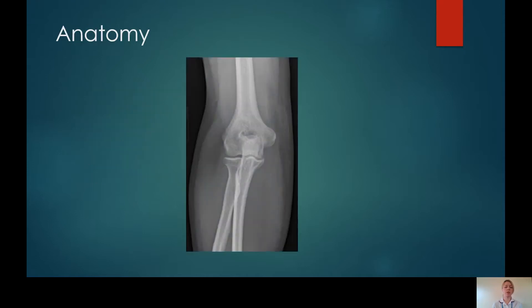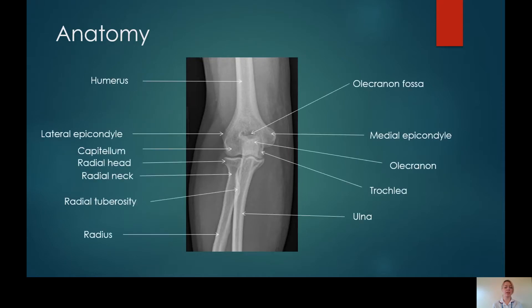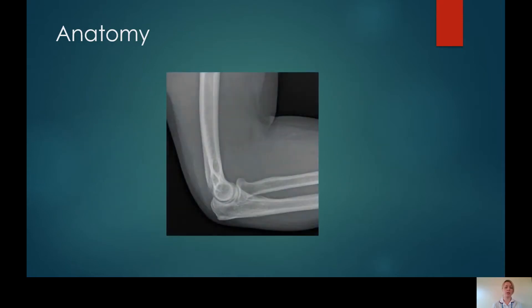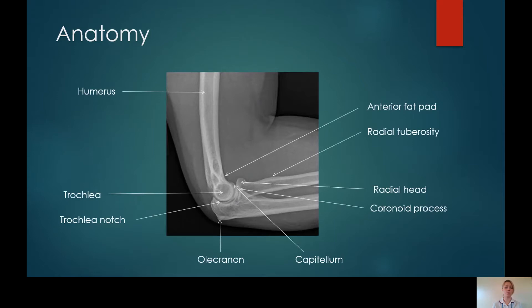We'll begin by looking at an AP radiograph of an adult elbow. I've attached some bony landmarks here and I'll let you look at this in your own time. And a lateral as well.